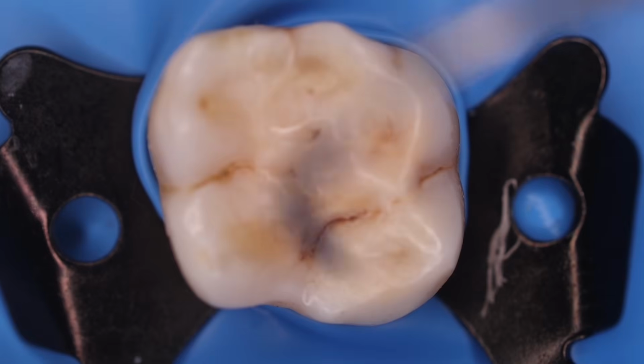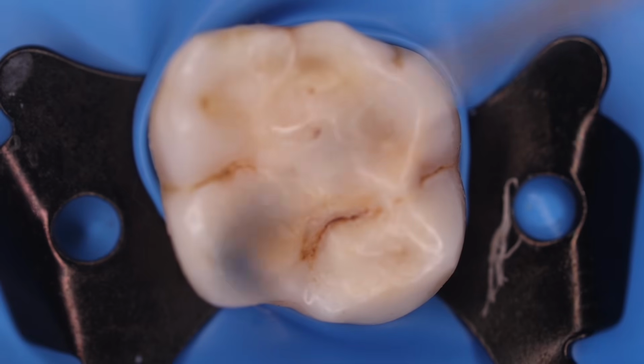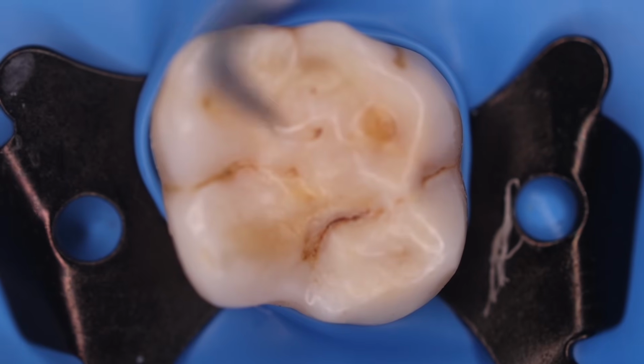Hi everyone, this is a maxillary first permanent molar, and in this video we are going to learn how to prepare an access cavity to go inside the tooth and inside the root for the root canal treatment. So this would be the initial step for the access preparation for the maxillary first permanent molar.